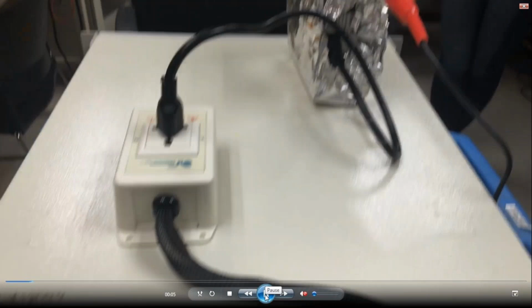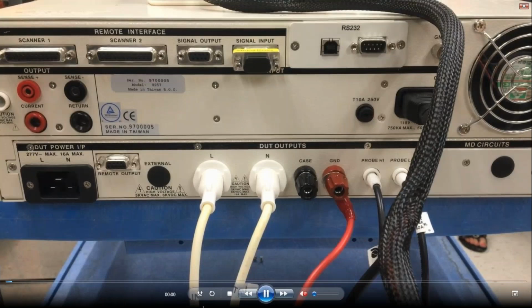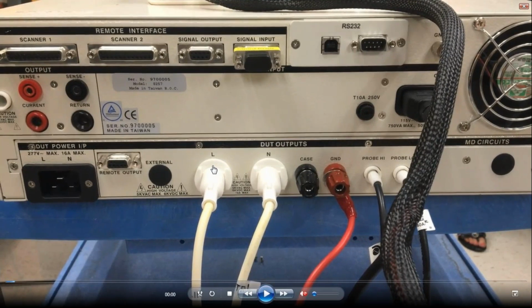We have the diagram that I showed earlier that had line connection, neutral connection, and a ground connection. So imagine this being your wall outlet: line, neutral, and ground. This is where the device is going to get the power from. Some of our instruments do have a built-in internal power supply that provides line, neutral, and ground. And you have your probing condition that may or may not be required for your leakage current testing.